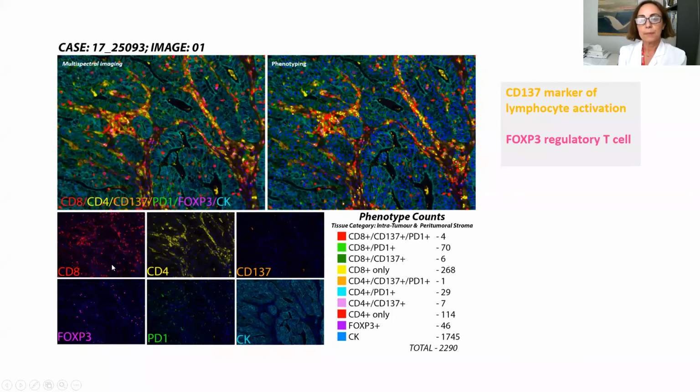We do immunohistochemistry, but the antibodies are marked with a fluorescent substance, and we perform different immunohistochemical analyses over the same slide. Every antibody is marked with a different color, and at the end, the system puts together all the different images of the different antibodies, and we see the distribution of the immune cells in the interstitium, and also the relationship of some immune cells with the tumor cells.